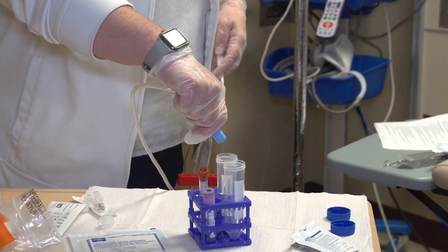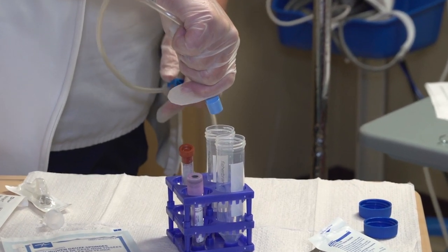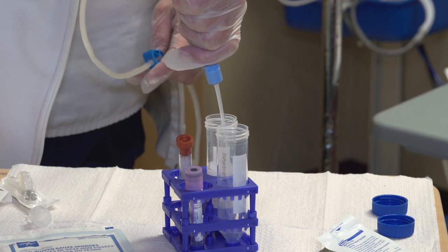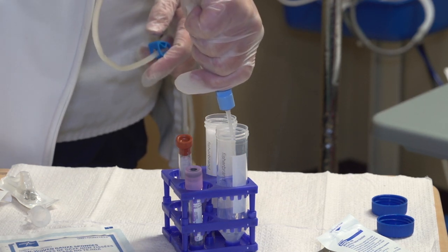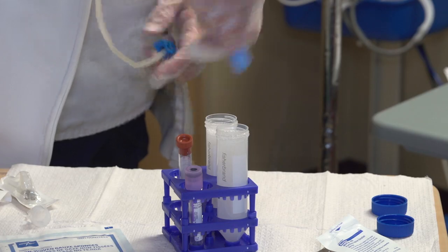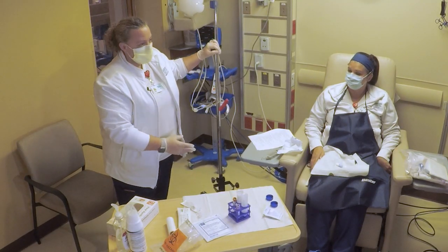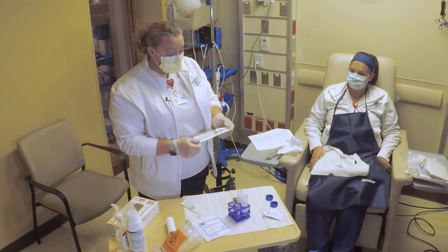You'll just open both lines and fill your Falcon tubes first. Fill them as close to the top as possible without touching the inside of the Falcon tube. Once they are both filled, you're done with this, so it doesn't matter if it gets contaminated.